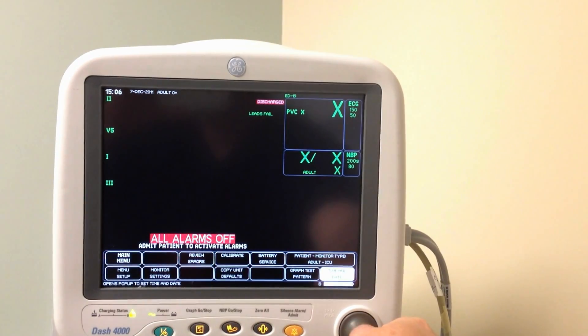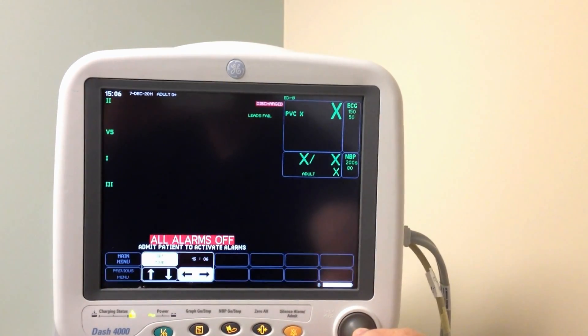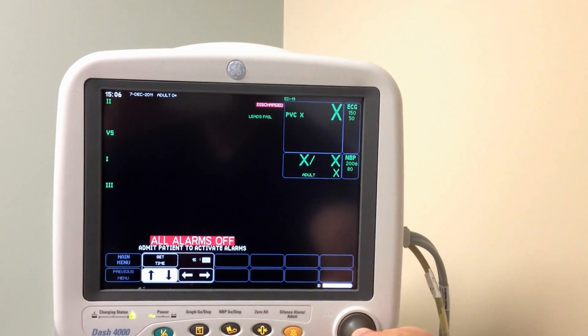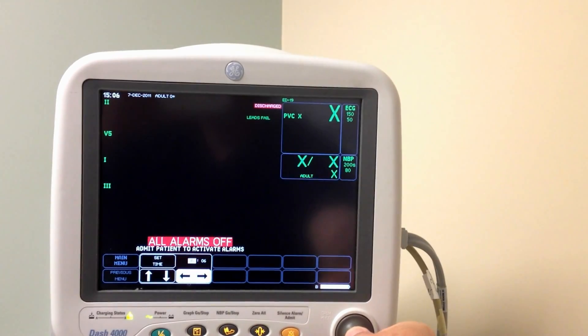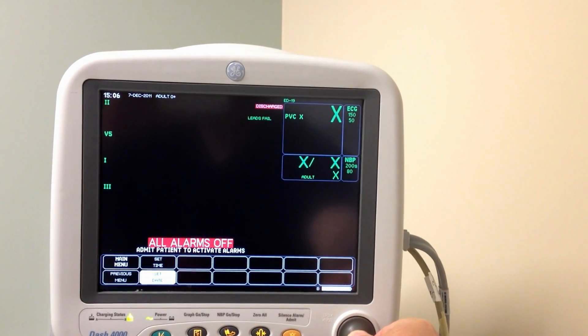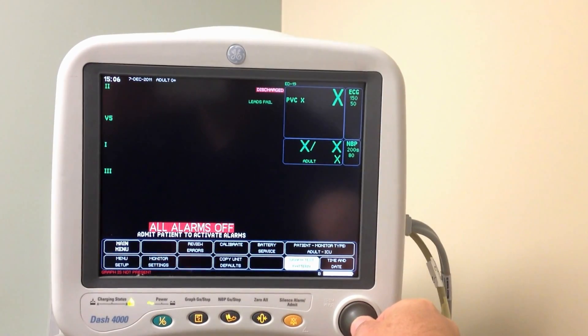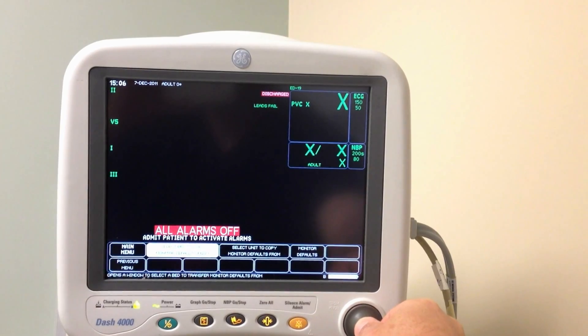We set the time here for the time. Graph test pattern. We have done a graph.